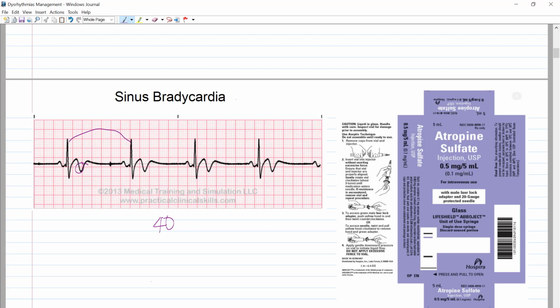So for sure, if the big boxes of the patient is 2, then probably the heart rate is 150 to 200 beats per minute. Okay. So what do we do with sinus bradycardia? Of course, the first thing we ask ourselves is, is our patient asymptomatic, with no symptoms? If the patient has no symptoms, we just have to monitor and observe our patient.